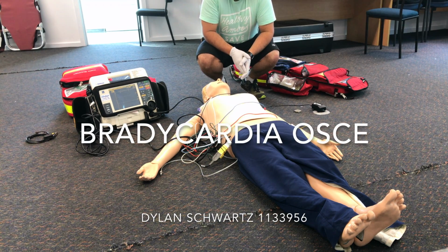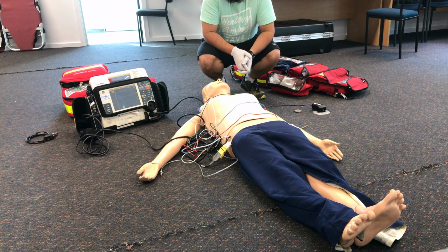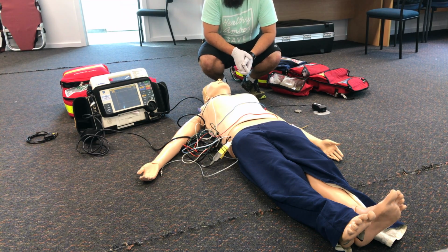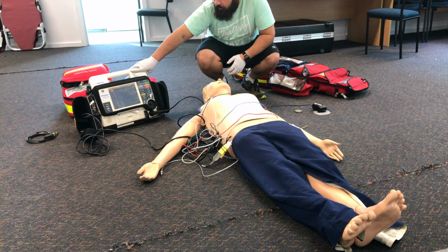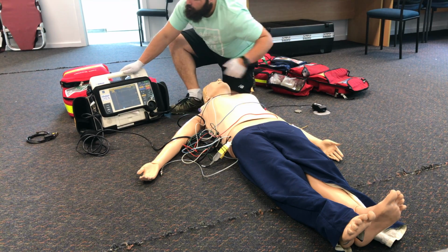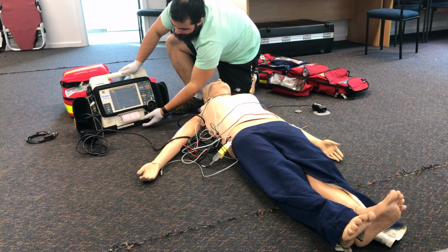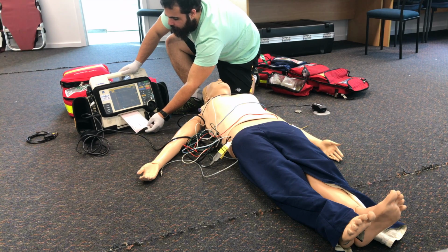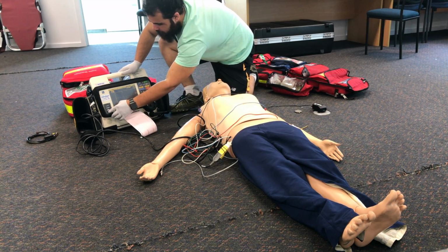To the bradycardia OSCE. We have a patient here who's presented with some chest pain earlier today. We've popped on a 3-lead, and as you can see, he's in a bradycardic rhythm. So I'll go ahead and print that. And I can see that it's wide complex bradycardia. Looks like a 3rd-degree block.